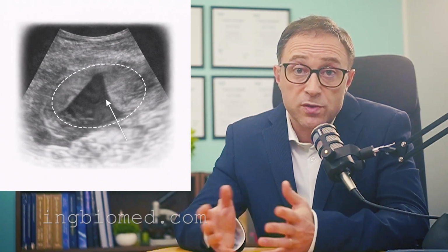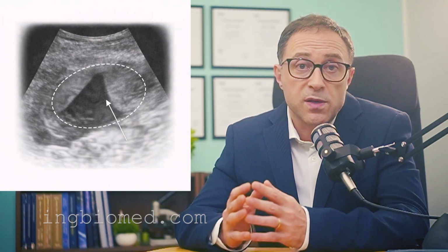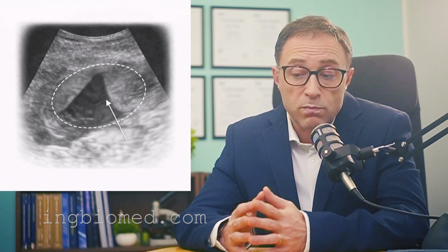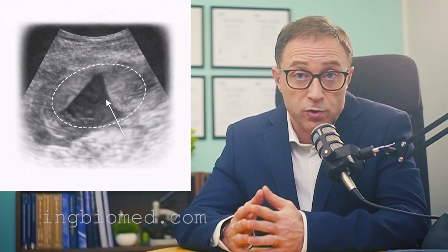Renal infarctions, typically embolic in origin, appear as wedge-shaped cortical defects following vascular territories. In chronic stages, they evolve into triangular hyperechoic scars and must not be mistaken for tumors.